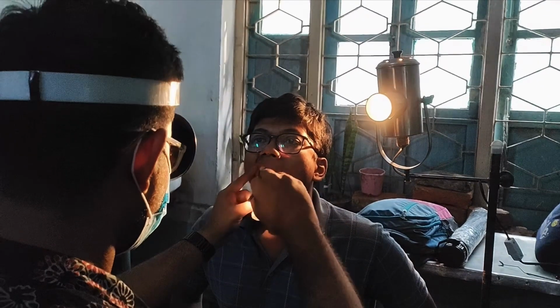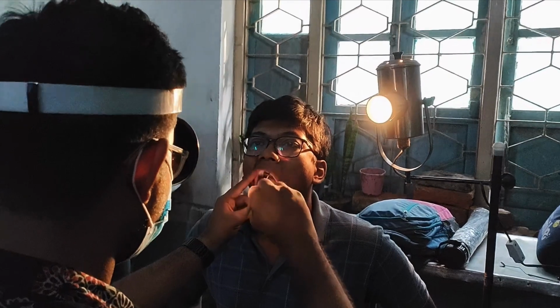So coming to indirect laryngoscopy. The setup will again be the same, like a bullseye lamp. The light is coming onto your head mirror, and now have a careful look at my fingers. My thumb and my middle finger are holding the tongue down with a gauze piece, and my index finger is lifting the upper lip.